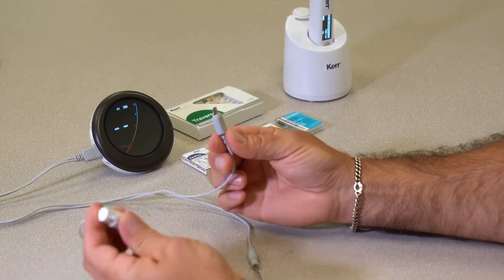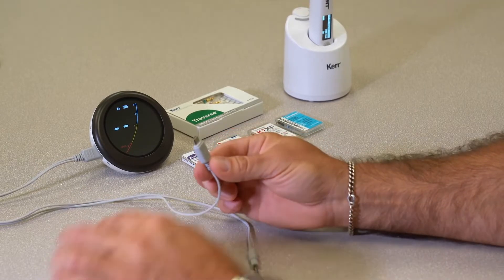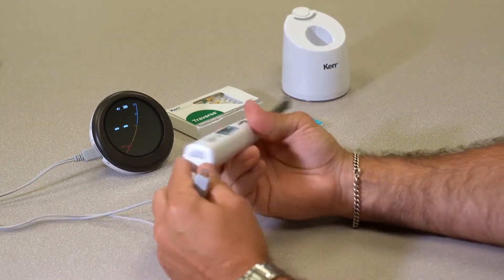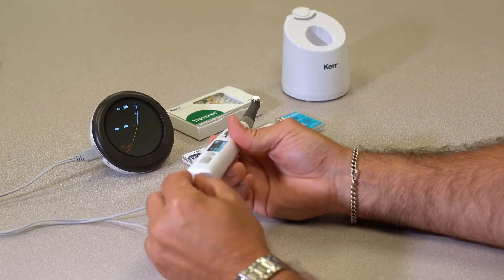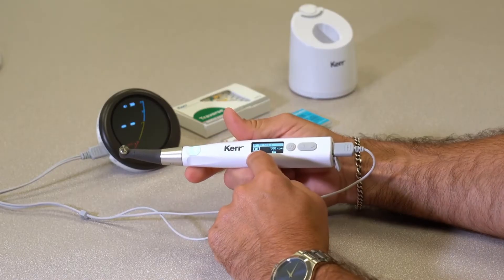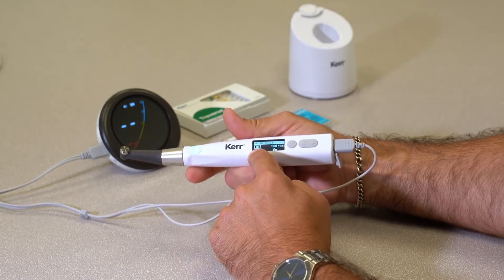However, instead of using your file clip like you would traditionally, you're going to come to your motor and there's a plug on the bottom here. Peel that plug back and then you're going to plug the attachment — that would normally go to your file clip — into the bottom of the motor. Immediately on the motor you're going to see EAL, which means Apex location.